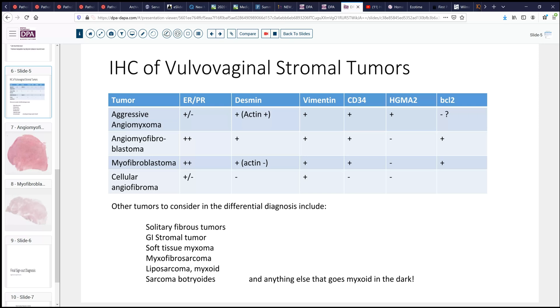Although, as you'll see in a moment, the histology is not particularly similar. We also have myofibroblastoma, which again can have hormone positivity, Desmin actin — usually actin negative — but has some other similarities. HGMA2 and BCL2 can sometimes help differentiate these two, but these are not always commonly available markers. The cellular angiofibroma or fibroepithelial polyp of the vulvovaginal area can also appear similar in some circumstances. And anything else with myxoid tissue — sometimes solitary fibrous tumors, GI stromal tumors, soft tissue myxomas — can all enter into our differential considerations in this location.